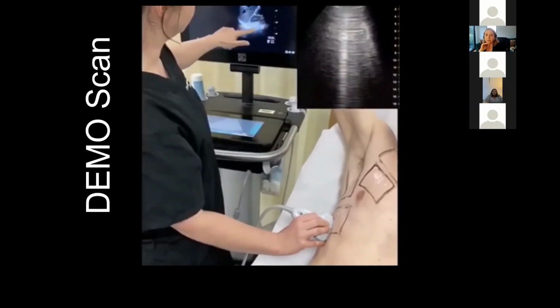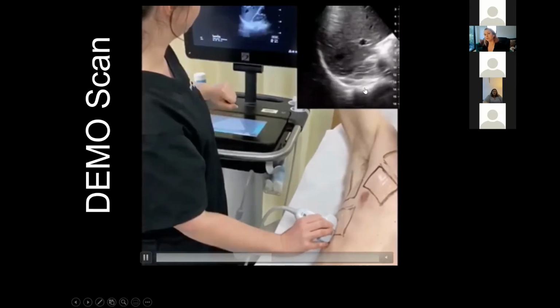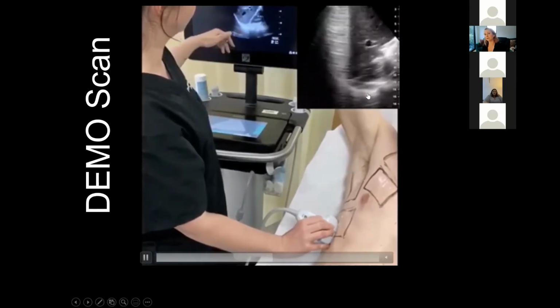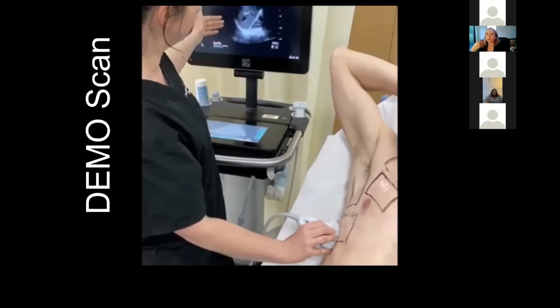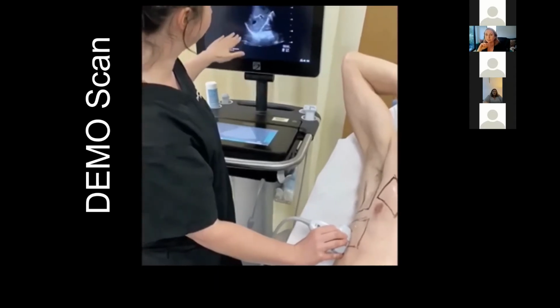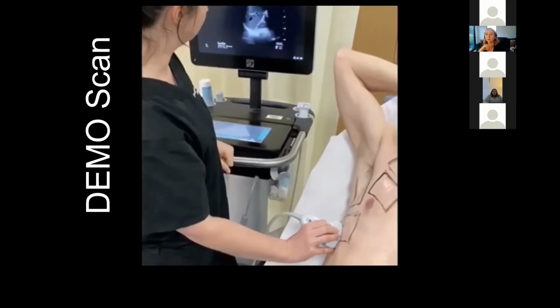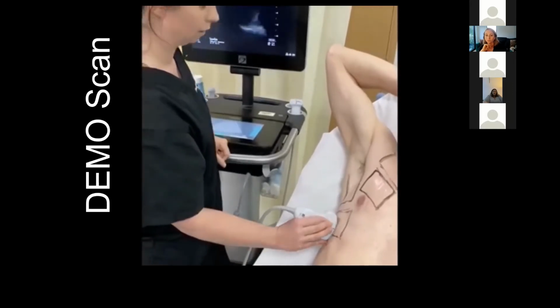At the bottom of that image, when it's in the abdomen, you'll see this undulating bright line. This is our thoracic spine. When the ultrasound goes through the abdomen, we can see that because it's got a medium that it can travel through. But when it hits the lung, we lose that spine because it's just reflecting all the signal.